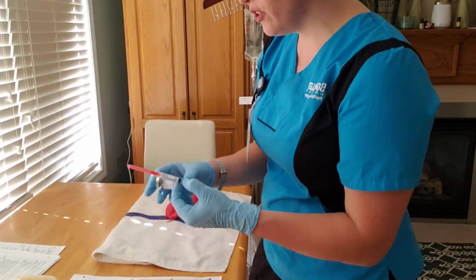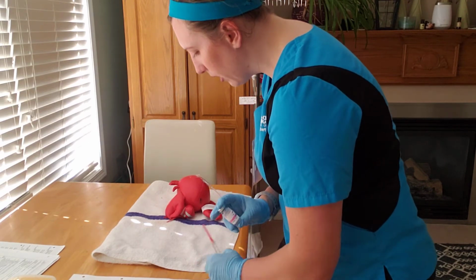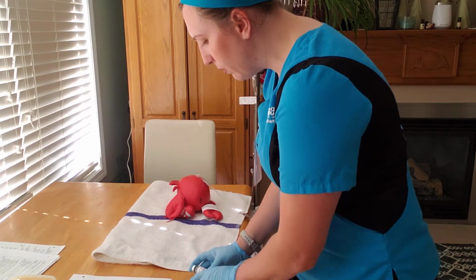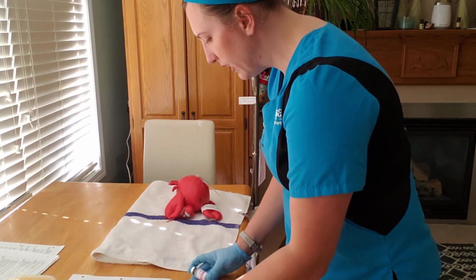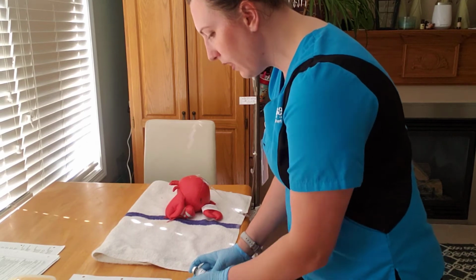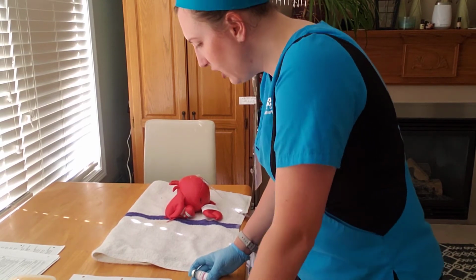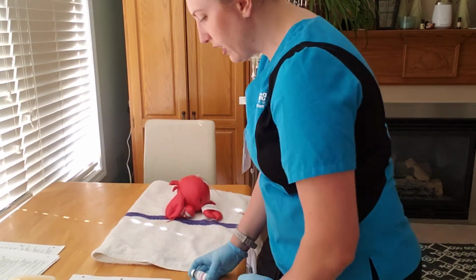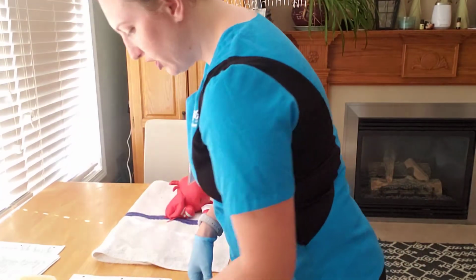So I withdrew 2 mils of ranitidine. Ranitidine corresponds to the MAR. 2 mils at 25 milligrams per milliliter equals 50 milligrams. So I have 50 milligrams of ranitidine in my syringe, which corresponds to the MAR. It's for IV, and for today, June 25th at 0700 hours, and for Chinook, Allison Chinook. Okay, so that's my second check there.